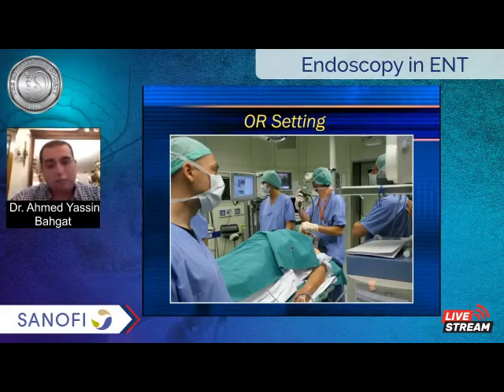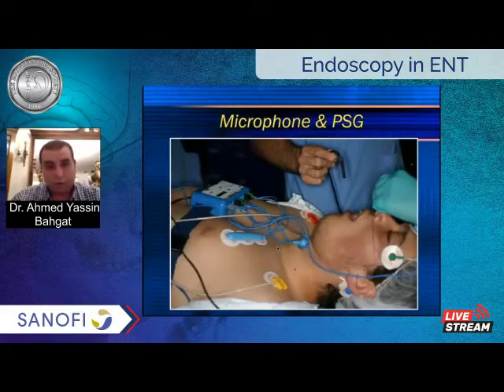But if you know how to do it when you are on the right side of the patient, it's okay, it's not wrong. And if you have a microphone or a polysomnography, you can use it to record snoring and to monitor the sleep during the endoscopy.